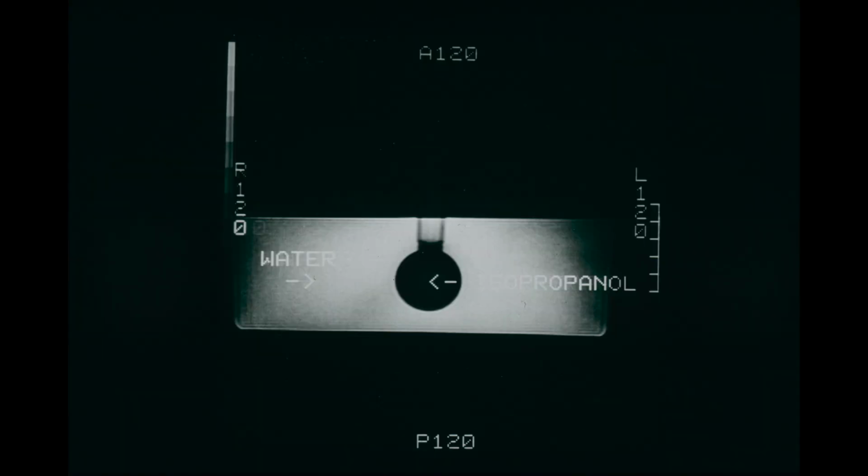So as an example of how this can work in a phantom, this is a dish of water with alcohol inside. You can prescribe where you want the data to come from. In this case, we want to collect it from inside the alcohol.